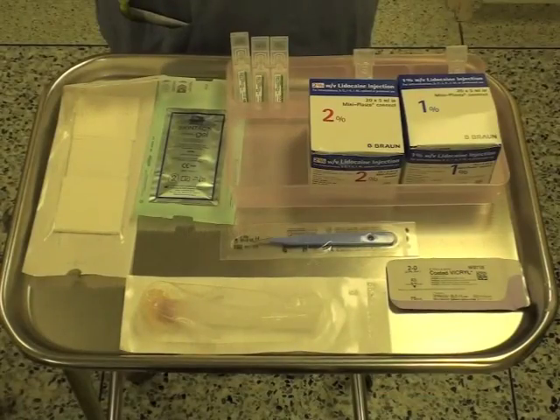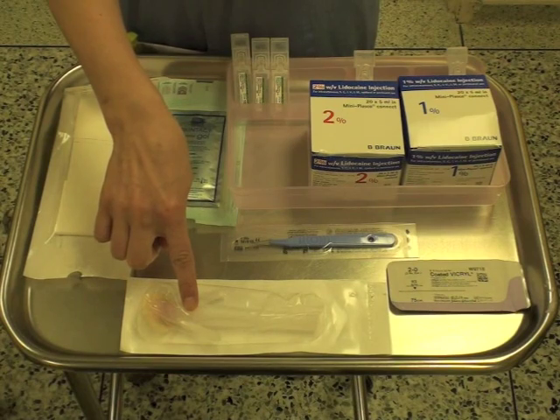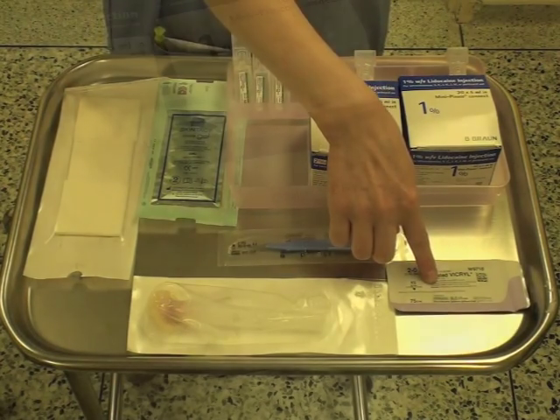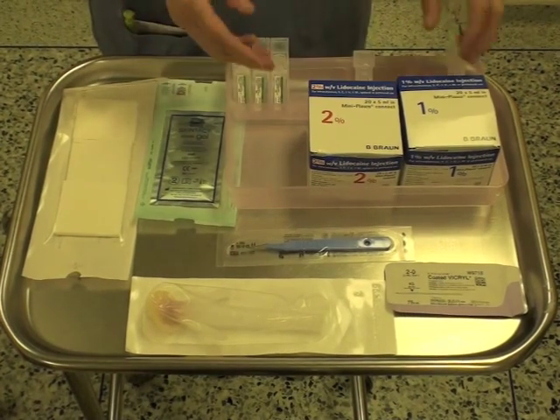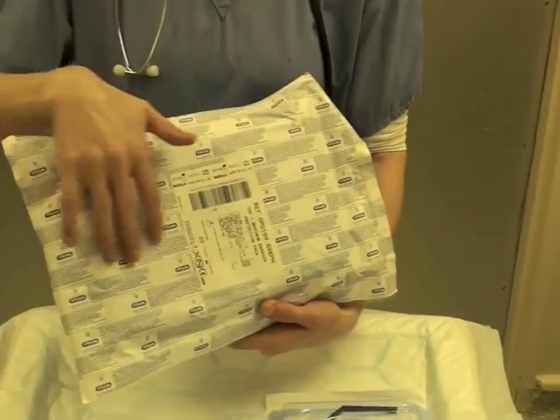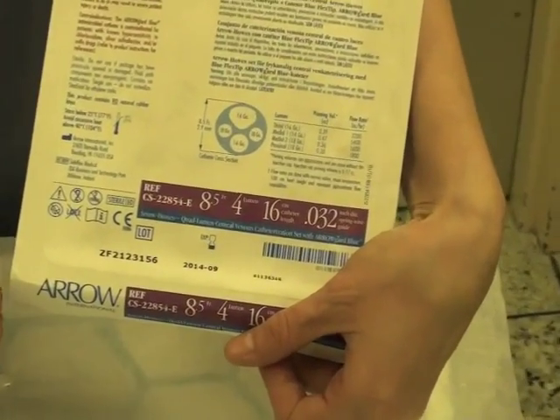Once all legal consents are done, start preparing and checking your equipment. Prepare additional equipment including a sterile sleeve for the ultrasound, sterile jelly, and an extra chlorhexidine stick. You will also need an eleven-blade scalpel, 2-0 coated Vicryl suture, normal saline for flushing the catheter, and one or two percent lidocaine if the patient is awake and local anesthetic is needed. Check the integrity and expiry date of your kit sets and the central venous catheter.